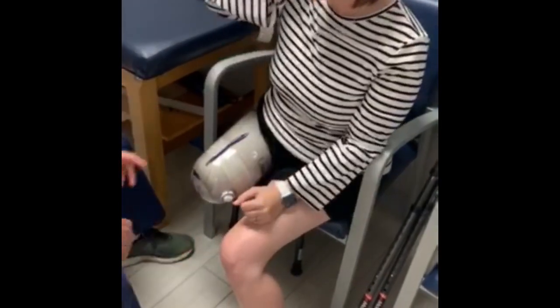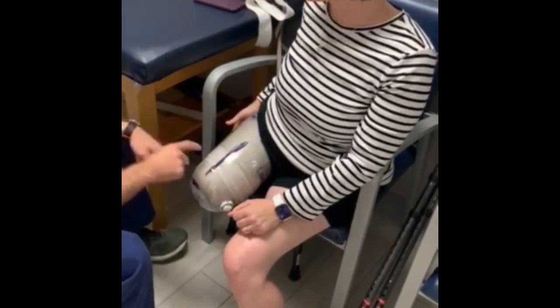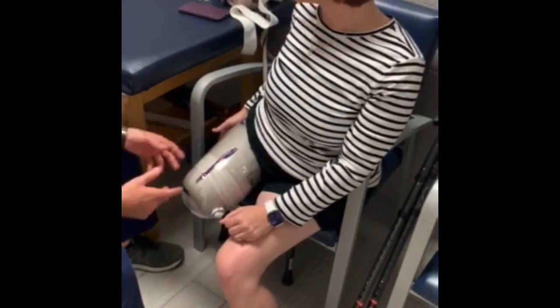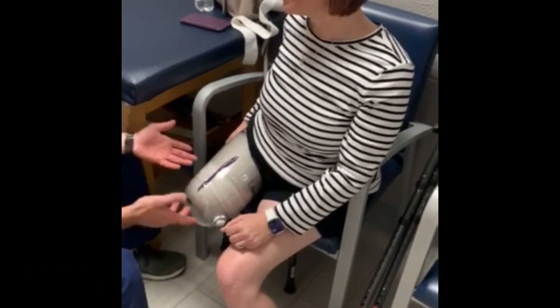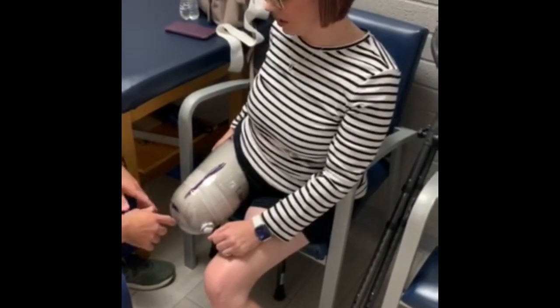I'll give you two scenarios. Let's say you're at a movie theater or something, and I'll go back a little bit further. At times, it may not be the most comfortable sitting down. I make walking legs, not sitting legs. It doesn't take any skill to make a leg for you to sit on. So let's say you're at a movie theater, sitting for a long period, or on a long car ride, something going down the beach or whatever.